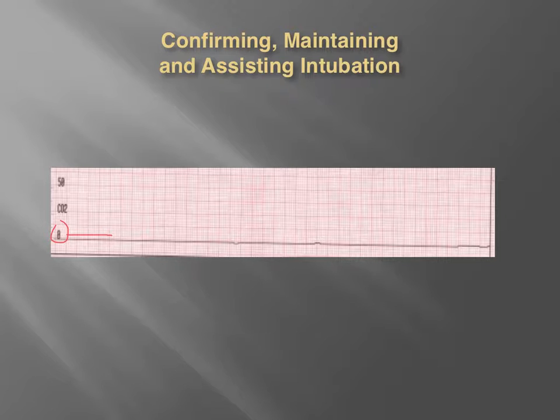Providing we're doing CPR if need be, ventilating the patient appropriately, and we have everything hooked up correctly, this line should not be, right? We should get some sort of waveform that's confirming that our tube is in place. So bottom line is, if we just have a flat line, we've got big problems. Then we need to reevaluate our situation.